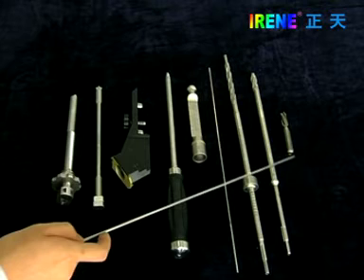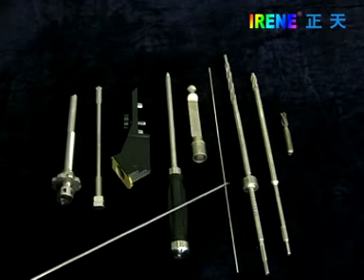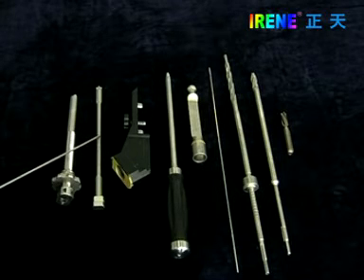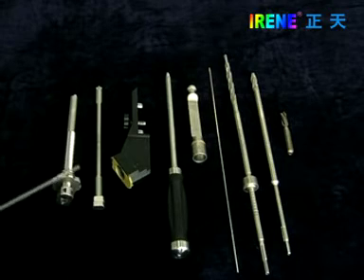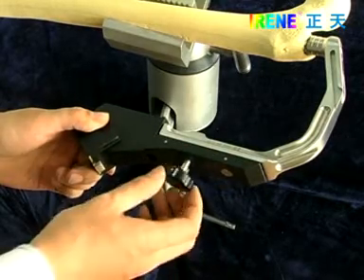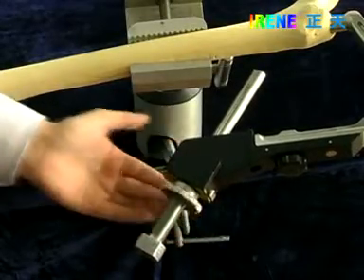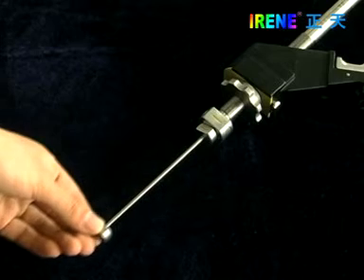These are the blade lag screw, 11 mm cannulated drill, limited drill, threaded guide pin, depth gauge, blade screw inserter, aiming arm, drill sleeve and pin, and protection sleeve. Connect the aiming arm onto the insertion handle and fasten with the bolt. Insert the drill sleeve and pin through the aiming arm and fasten the bolt. Take out the pin.